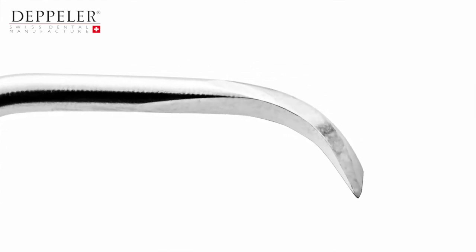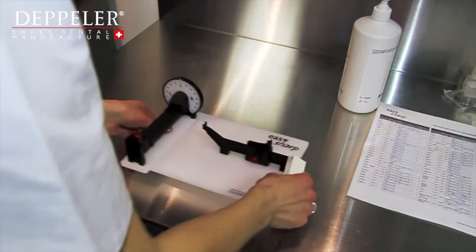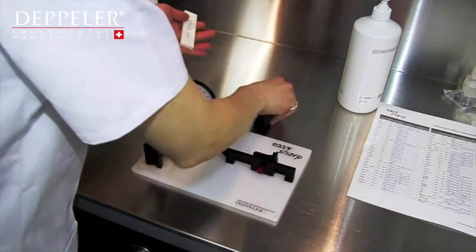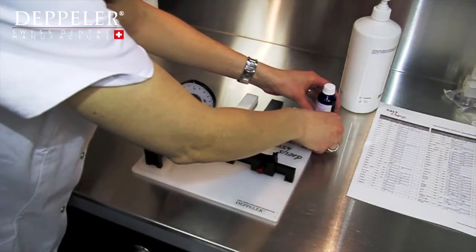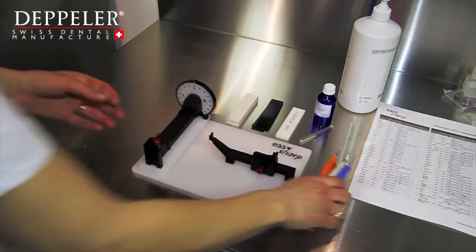Don't hesitate to look at the tips of your instruments with a magnifying glass to check their state before and after sharpening. You will need the following: the EasySharp appliance, the table of angles and movements, a black rubber spacer supplied with the appliance, sharpening oil, a test stick, and of course the instruments you want to sharpen.